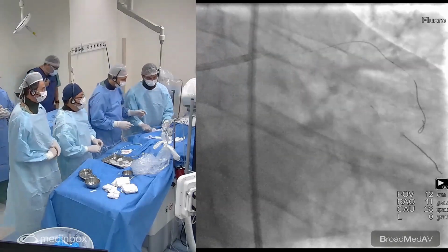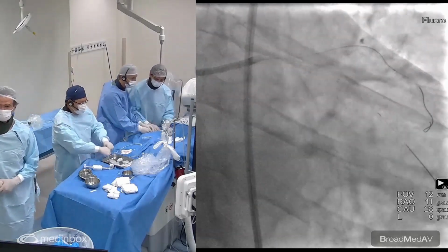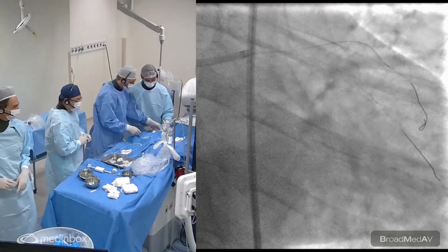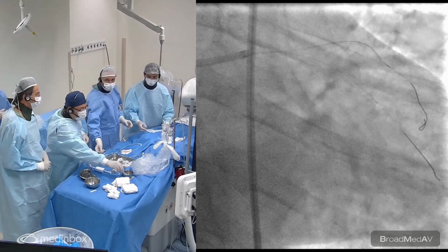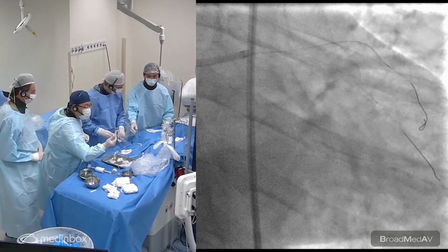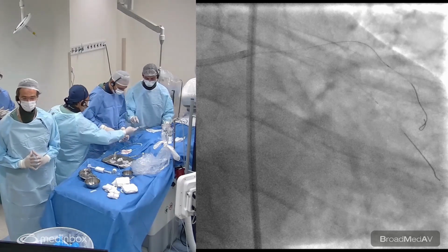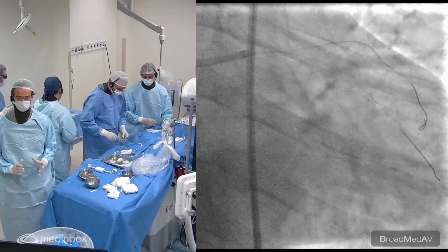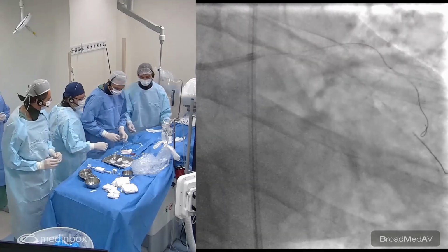So it's open, as you can see here, there is distal flow. The disease seems to me a little bit longer than we could realize. How long is the disease, Rodolfo, the extension? We're going to do a nitro now, and then a control angio. So we are bringing some nitro. As I mentioned to you, it's important: don't get rushed. Do some nitro, get the true vessel size. So Ricardo is proceeding with the nitro, as you can see here.